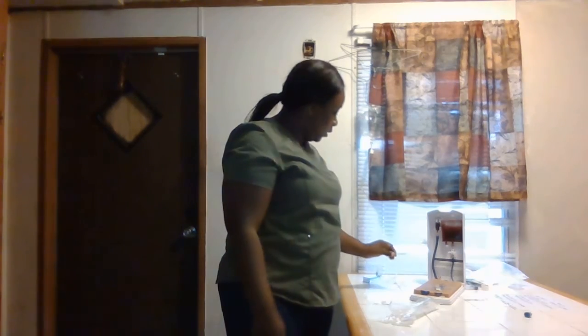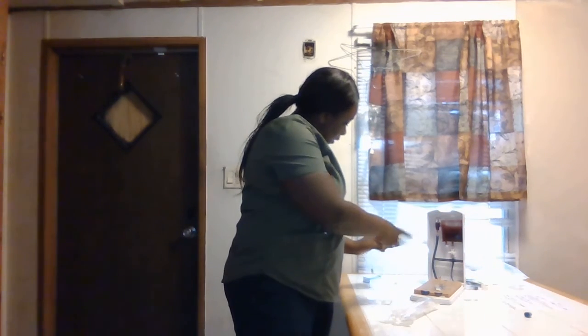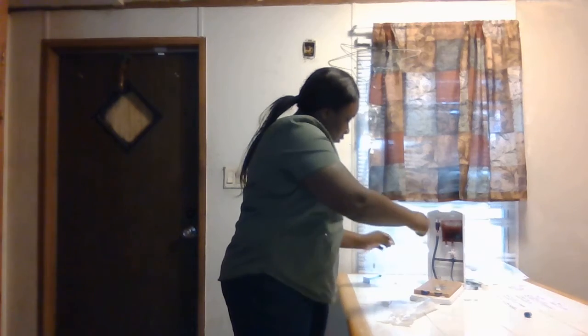Again, I would have on gloves. I'm just talking through this part. And take off the end, and that's sterile, so you won't have to clean this part, but you just hook it up, and you kind of want to watch it while it's going to the patient. Then press start.